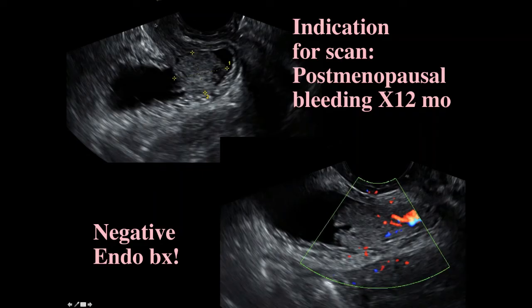So here I am starting to look at the urethra, and there's the vagina, and going down into the cervix down in here. What's this? This is a big mass. And if you turn on it, you can see that it's really quite large and it's very vascular. This is in the bladder. So then I'd start talking to the patient and I say, well, when do you see the blood? She said, well, when I wipe.